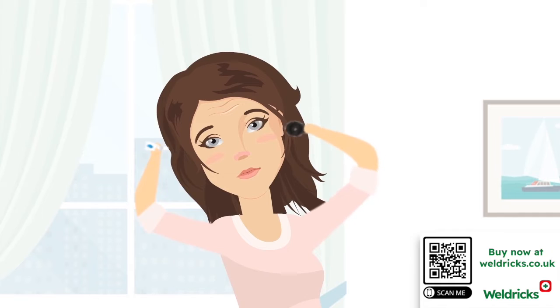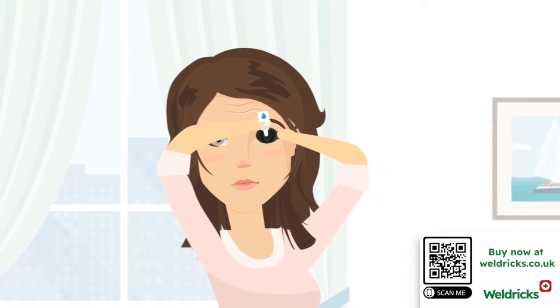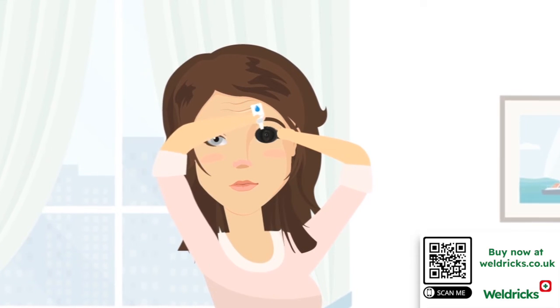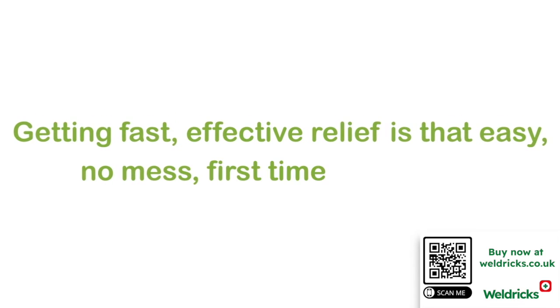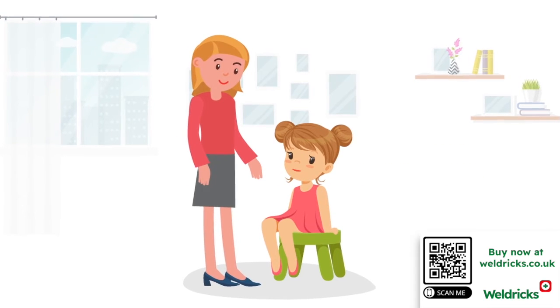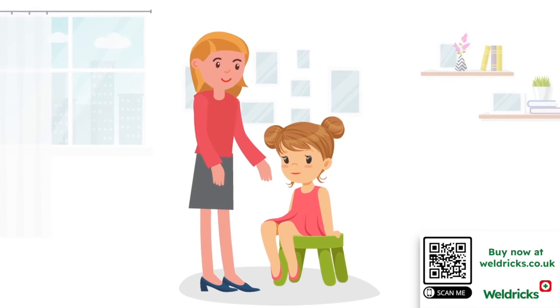Easy Drops is a simple-to-use eye care applicator that helps you put eye drops into your eyes first time, every time, right into the center of your eye. The clever part is that you won't even see the drop coming. Getting fast, effective relief — no mess, first time every time. It's also just as easy to help a friend or loved one put drops in their eyes, like a child or an elderly individual.